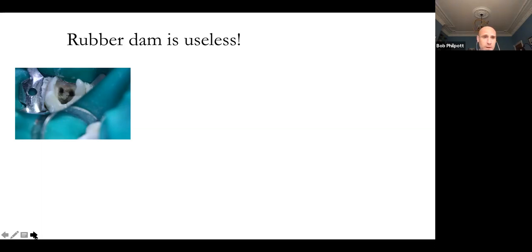So the rubber dam placement on this tooth that you can see in the image is fine, no problem. Well adapted cervically, some oral seal around it. But for me, there's no four-walled cavity. So doing access in this tooth without a four-walled cavity, looking for canals and trying to instrument them is crazy, because not only biologically does it mean that you're going to have something leaking in or out, but also what happened was, because I was so preoccupied with whether this was leaking, I ended up perforating in the floor of the pulp chamber. And you can see that there's an MTA repair there. And that's my fault. I hold my hands up there and I say, that was just not sensible to do it that way.